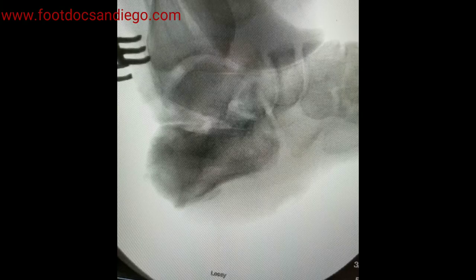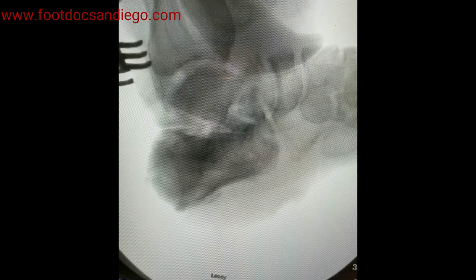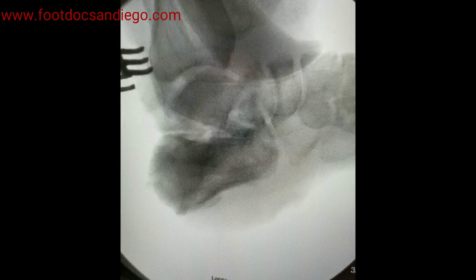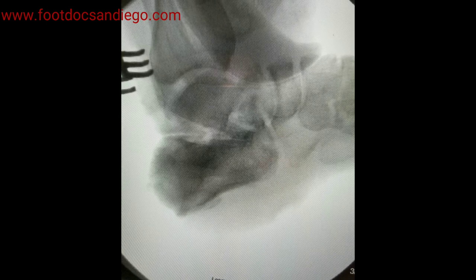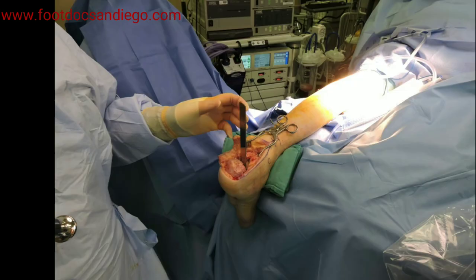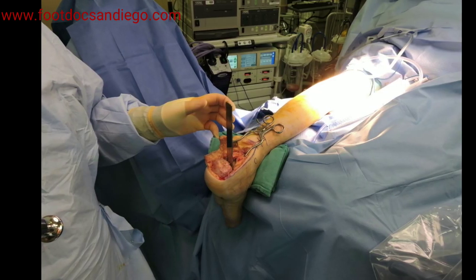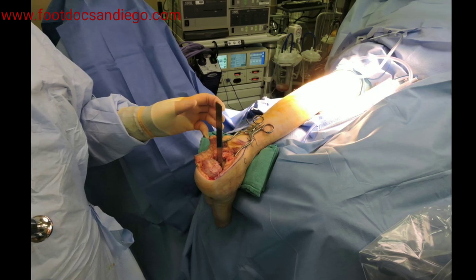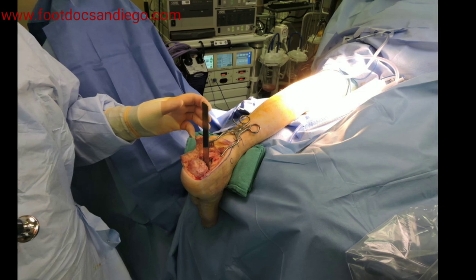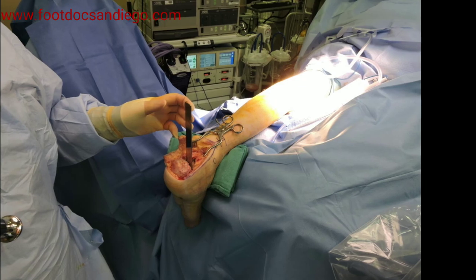Once that cut is completed, we will slowly be able to distract out in the operating room to correct the deformity. This deformity is now getting distracted out to put the calcaneus in the right position. What we are looking for is to create about a 20 to 24 degree calcaneal inclination angle, and that was dialed in with our preoperative planning of the correct size of the implant.